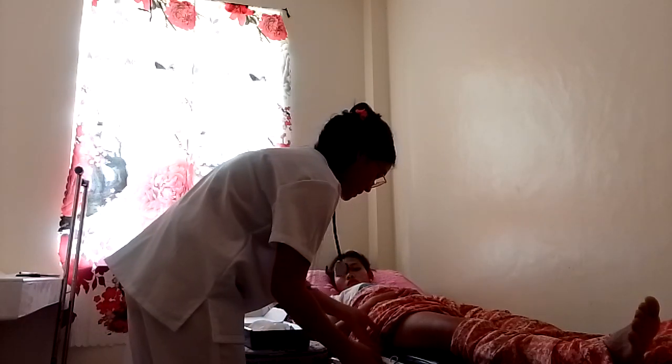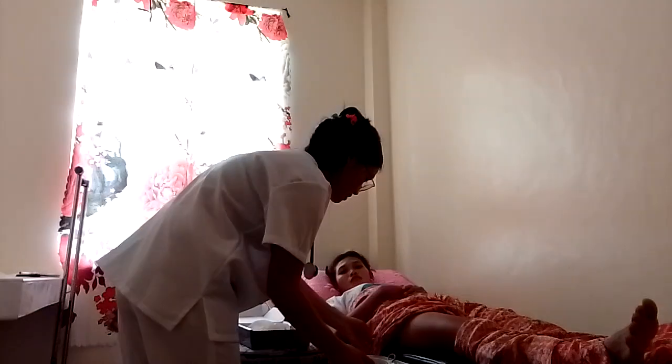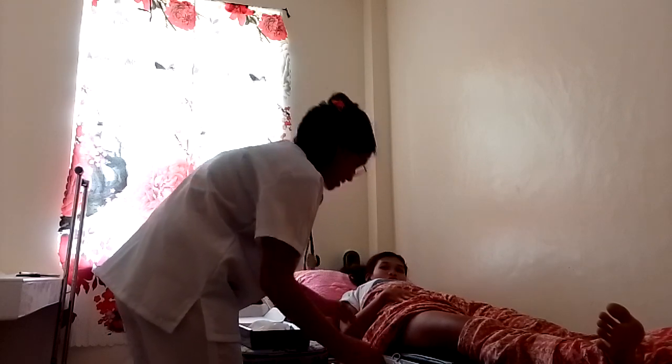Okay. So, ato lang ibutang lang nato siya sa ato ang bedside table. Okay na ka, ma'am? Okay na. Okay. So, nanadiri ang ato ang dressing tray. So, after that one, we need to apply dressing. So, mag-apply na ta og dressing. But before that one, mag-dry dressing usata. Okay. Wet and dry dressing.